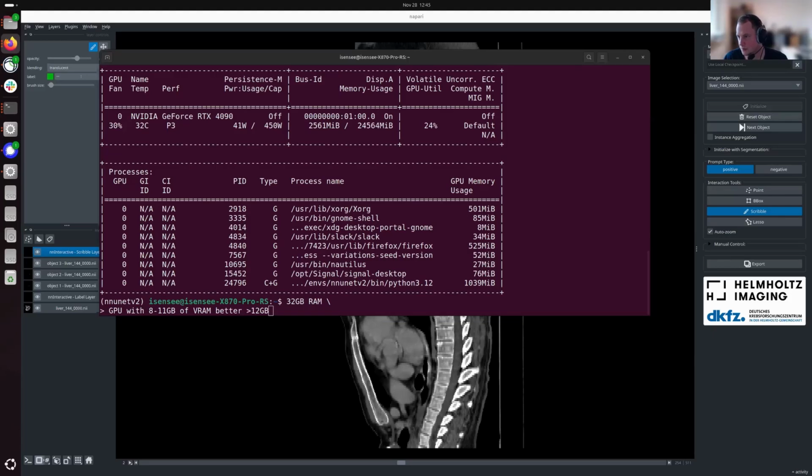All of these images are floating point, and we are using some sort of intensity decay between interactions, also simulated interactions, so that the network can see a little bit of the history of prompts: what the recent prompts are, what the one before that was, what the one at the very beginning was. We do that in order to inform the network better about which prompt it should prioritize.